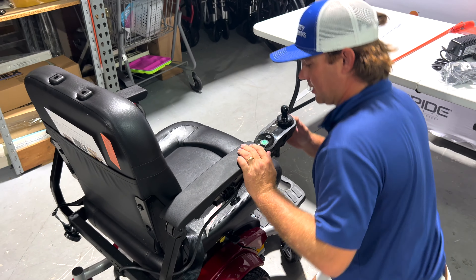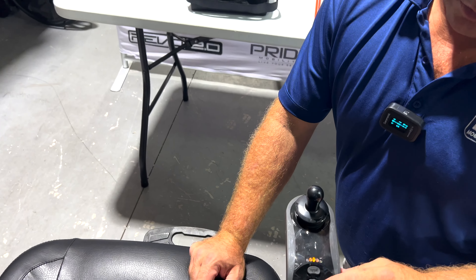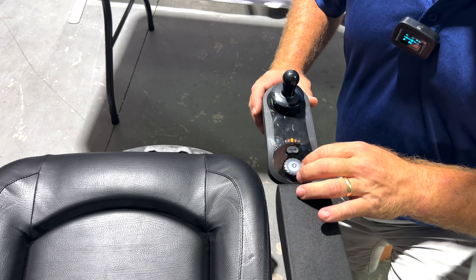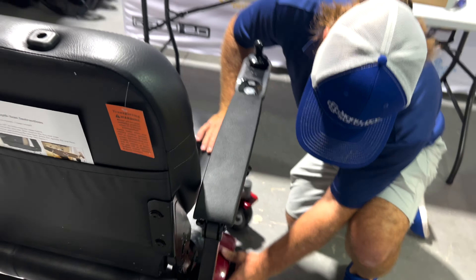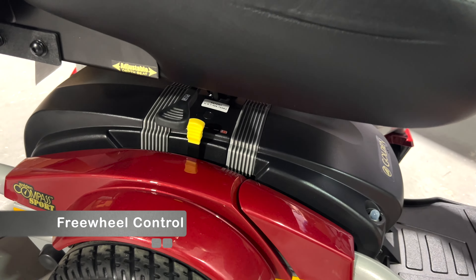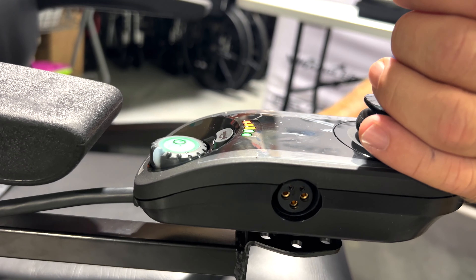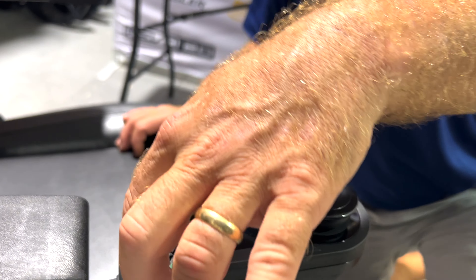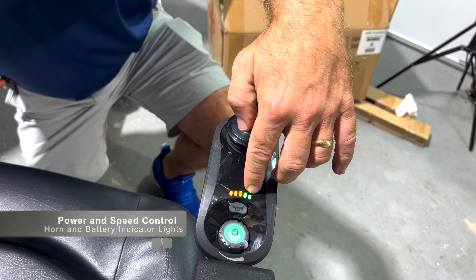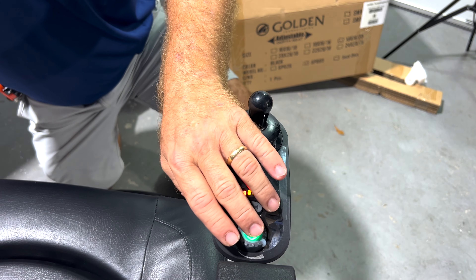We'll turn this on real quick. This is going to flash at you. The reason why it's flashing — this tells you what's wrong with it, or this could be scrolling because we're in freewheel. Now, it's going to be a little bit harder to push, but it can. So you turn that off, and then you have your freewheels. This locks the unit so it won't move. When you turn this on, it should be ready to go. This is your speed — slower is usually towards the red, faster is towards the green. There's your battery indicator. Give that a good full charge before you operate it.